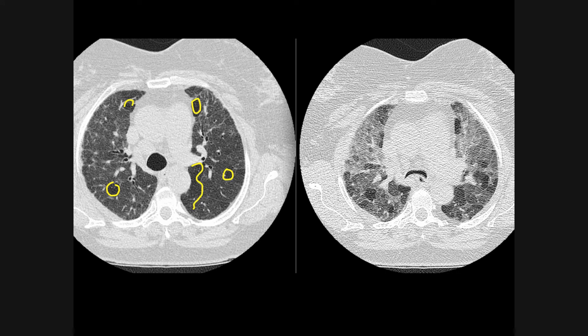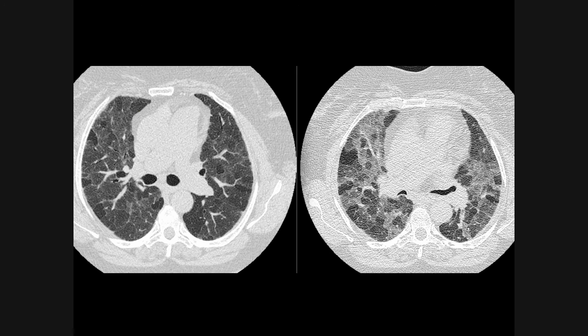This demonstrates that on expiration the areas of reduced attenuation remain reduced, and the areas of grey lung become even greyer during expiration. There is an accentuation of the difference in density between the areas of air trapping and the areas of alveolitis. Note that the posterior wall of the trachea has gone inwards, denoting that this is an expiratory scan. These are axial slices a little lower down on inspiration and expiration.